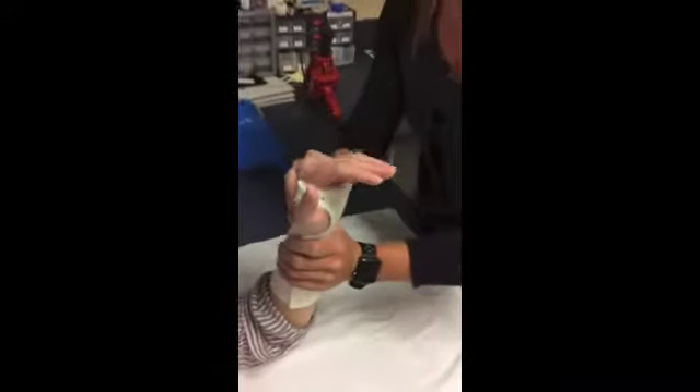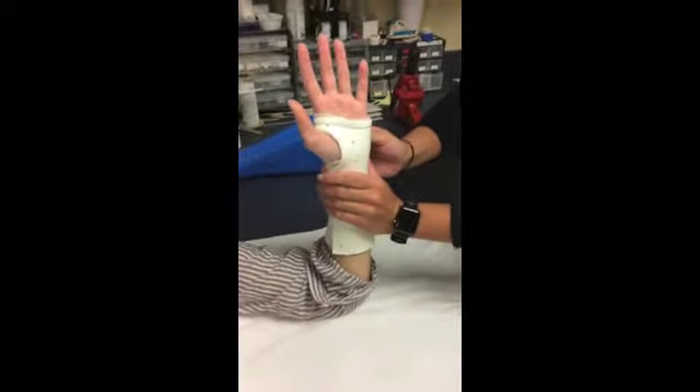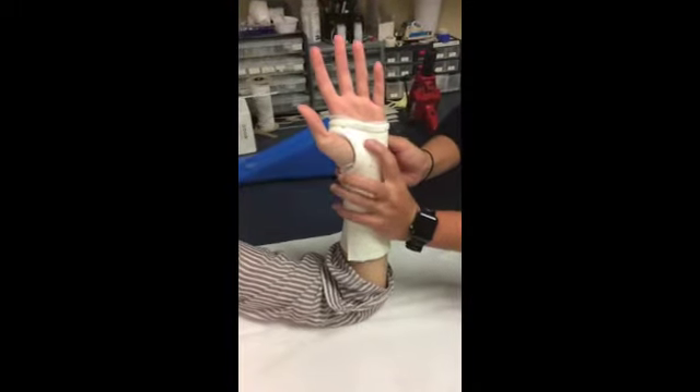Also make sure that this part of the orthosis is clearing the index finger MCP. Make sure again that it's clearing her distal palmar crease. You're at about 30 degrees of wrist extension. The patient can still oppose to each finger, and that thenar eminence is clear.